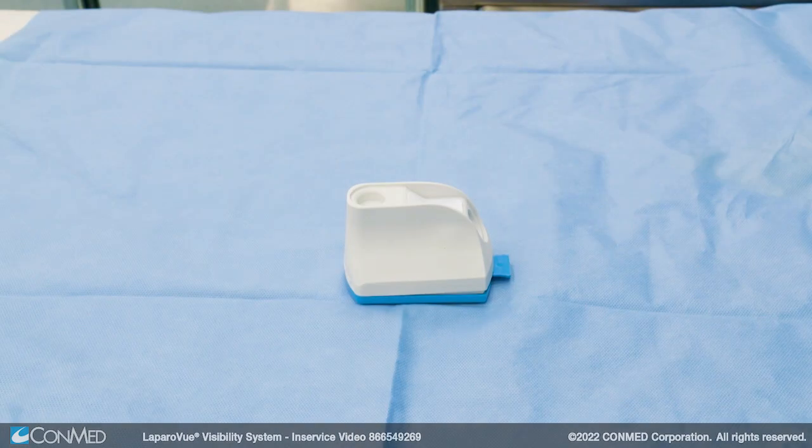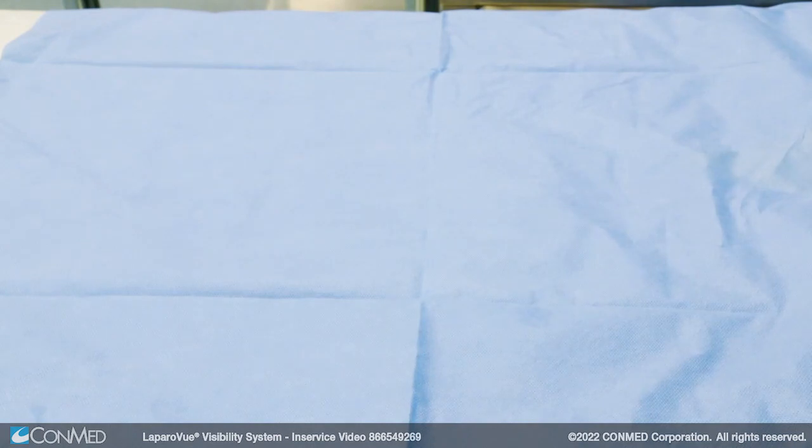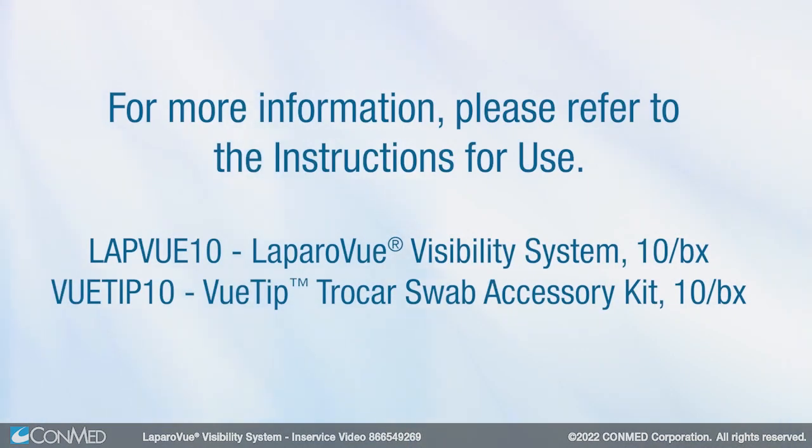After the case, the unit should be disposed. Batteries can easily be separated from the unit by removing the top housing and then the internal plastic housing. For more information, please refer to the instructions for use.